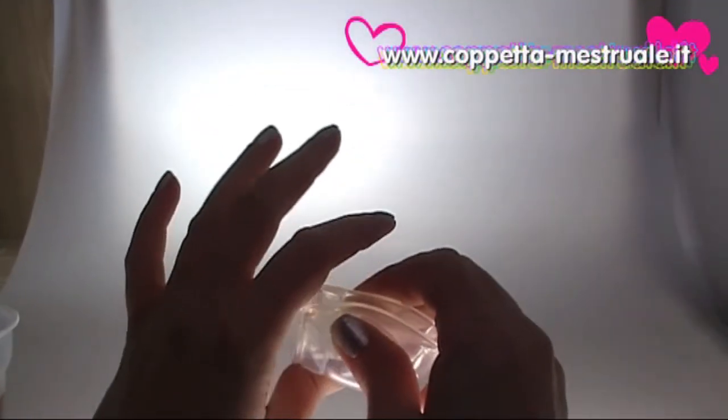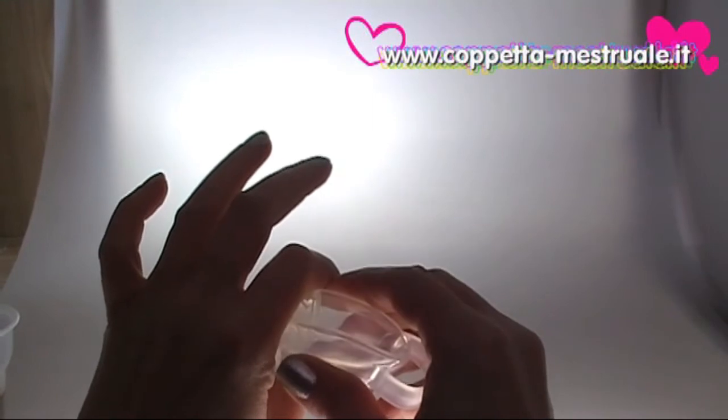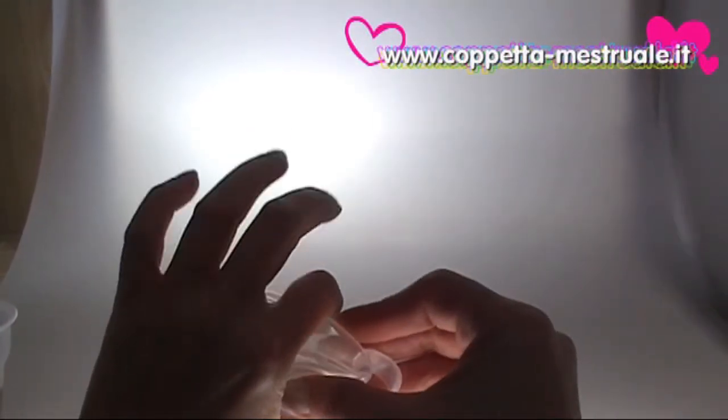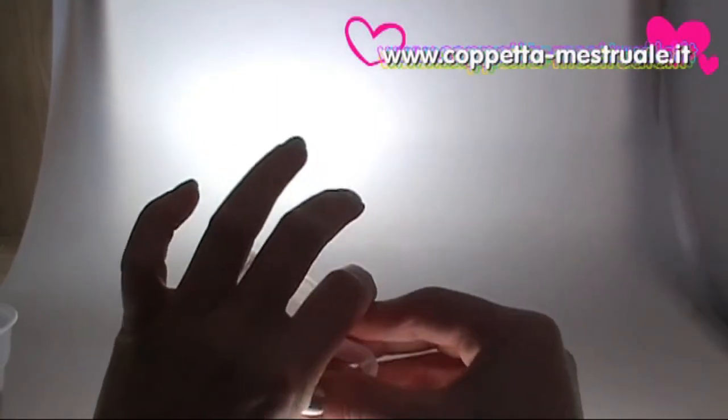Hold the Femicycle firmly and insert it very slowly into the vagina. Keep pushing it slowly until the removal ring enters the vagina. That's all.